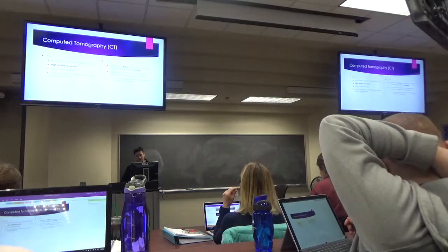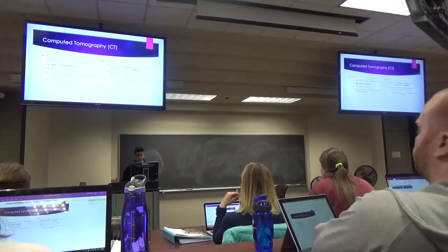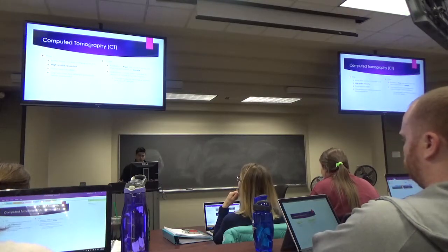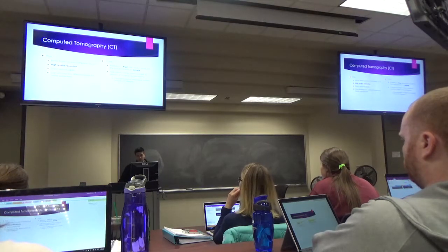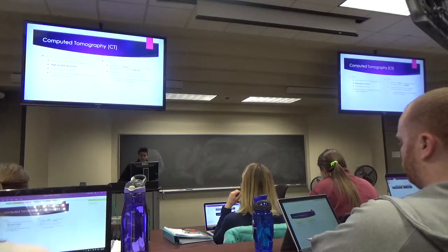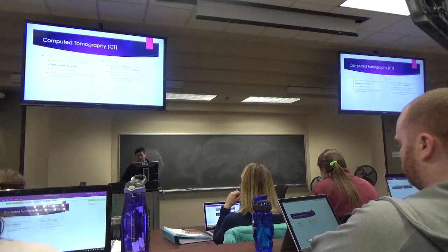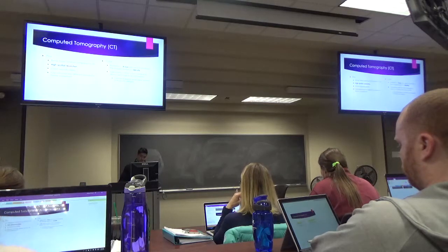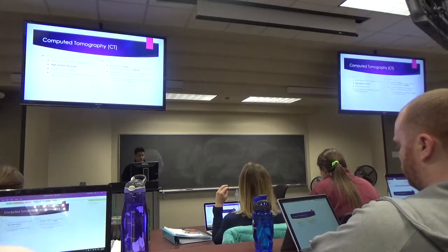The cons for this, though, is that it is radiation. So X-ray, the plain film, those are radiation because we use X-rays. Ultrasound, again, no radiation because it's just sound waves. But this one does use radiation. And again, X-rays are used for these images based on density, just like we talked about with the plain film. And iodinated contrast is often needed to detect or further evaluate certain lesions. But the reason why I put this as a con is because people with renal failure, for example, or certain allergies may not be able to receive the contrast. So that can limit you as well.